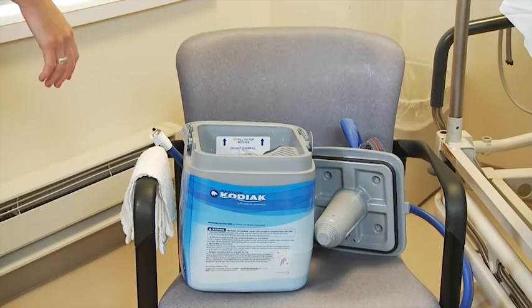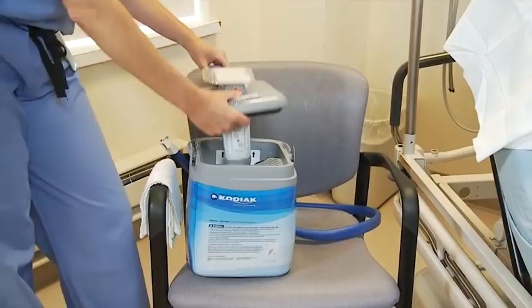You want to put the cover on top. You want to make sure the hose is facing to the rear. Place the cover right on top and you pull up the lever. You'll hear it click.